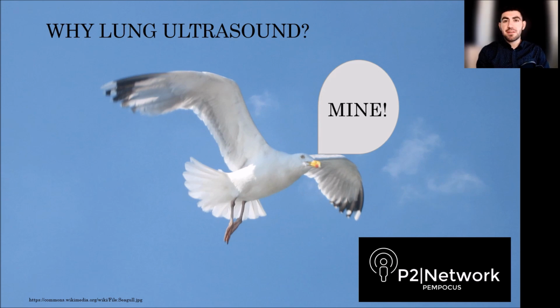Lung ultrasound doesn't belong to anybody. This is just information that is free to obtain. We can get it pretty easily right at the bedside, pretty quickly. It helps to build rapport with our patient, and I find that kids don't get so worried about it. It actually ends up being a nice experience with your patients.